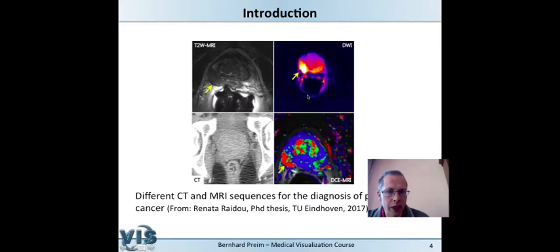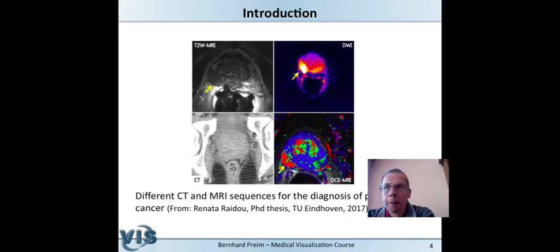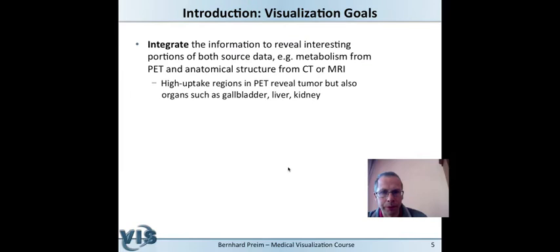Different information related to the same patient is shown in different images, and the pathology is not always in the same location across data sets. It is quite challenging for a physician to mentally integrate this information without software overlay support. What we want to support is the integration of the interesting portions of both source data sets.